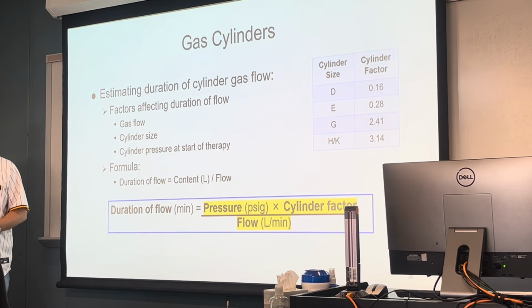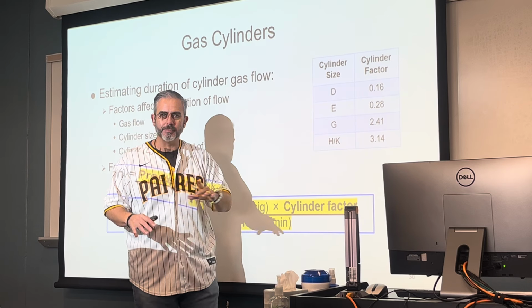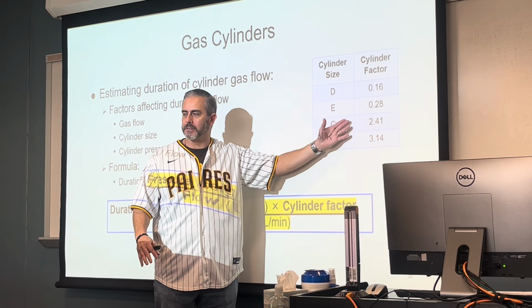And I would always say, if I want this thing to last the maximum, let's start with a full tank. Don't give me one that's half full or 3/4 full. If I want it to last as long as possible, let's start with a full cylinder. So, some of these cylinder factors you have to know, because you have different size tanks, and we have to make adjustments for the cylinder size themselves.